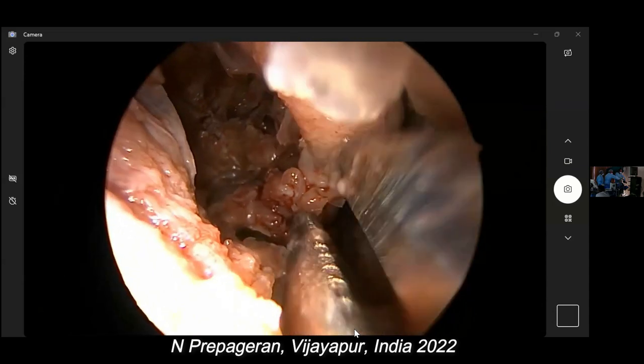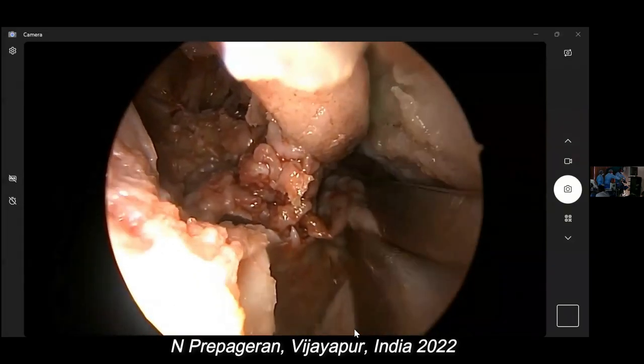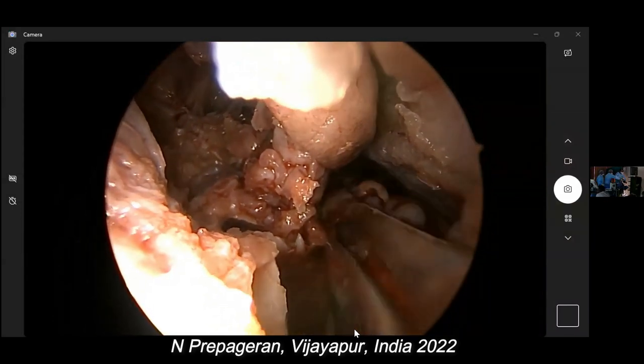We're going to cut the inferior turbinate. Your scissors are just like my hospital one, doesn't cut.